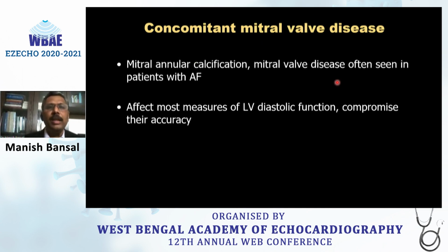And finally, mitral valve disease is quite commonly present in these patients, because they are often elderly and mitral annular calcification is common. So this adds another layer of complexity to this whole process.